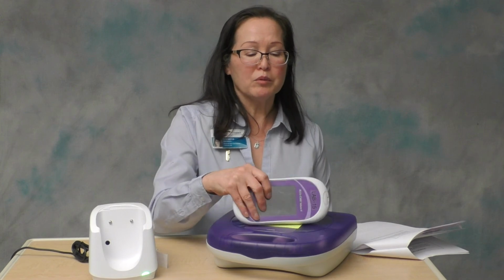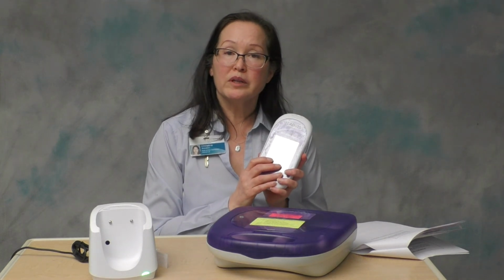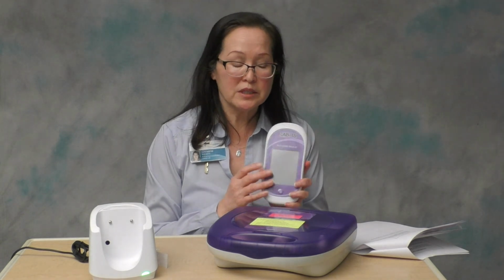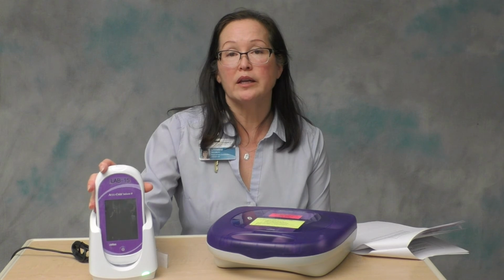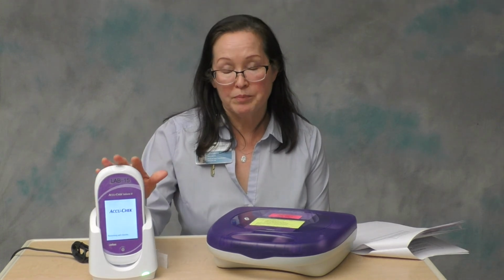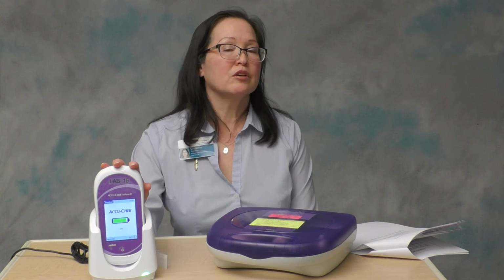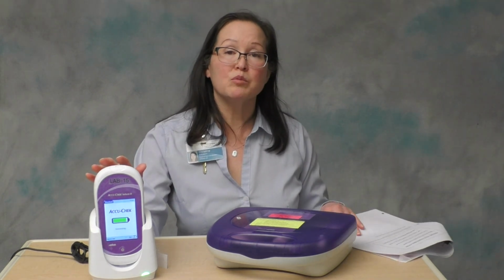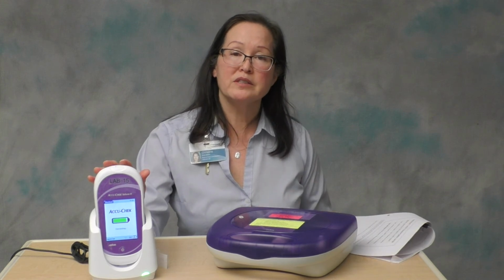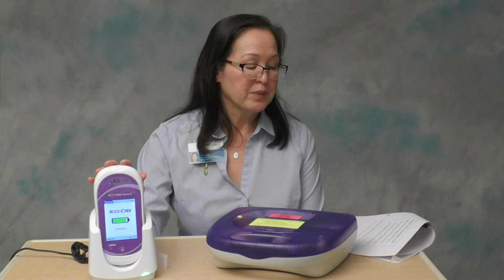Now, times when you would want to repeat a test result: if you got an error code when you were running the test, you want to repeat it. Also, if instead of a numeric value you got low or high, you'll need to repeat the test on the meter. Or if the result doesn't match the clinical presentation, repeat it on the meter. You want to do all repeats within 10 minutes. That prevents a duplicate financial charge being assessed to the patient.